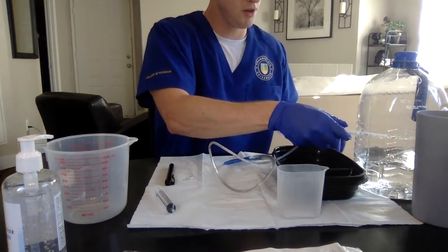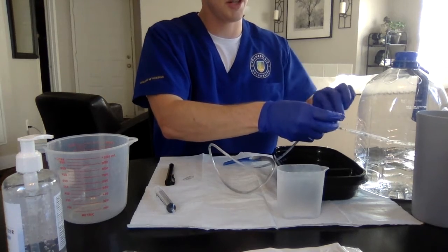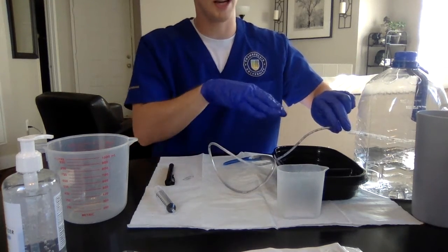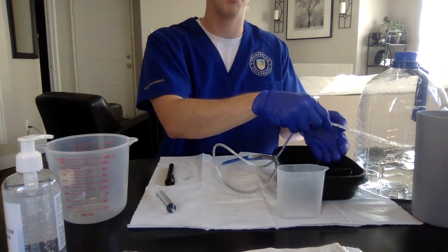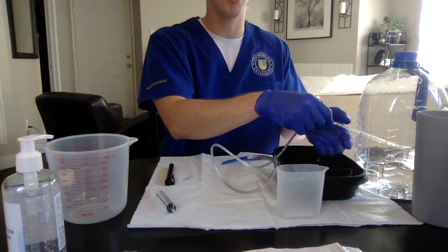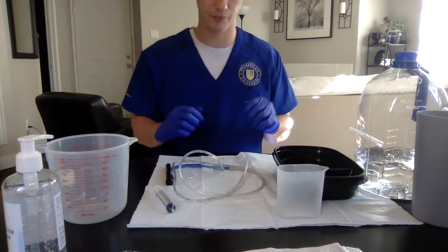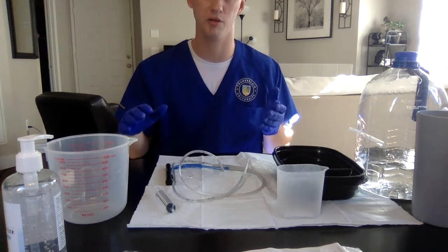Alright. So now we've removed all of the tape around this area. We flushed it with the 20 milliliters of air to get all the gastric contents out. So we're going to place a towel or something underneath our patient here. We're going to ask them to hold their breath for a few seconds, and then we're just going to pull, and it's out. So now at this point we would dispose of all of our materials in the appropriate receptacles.